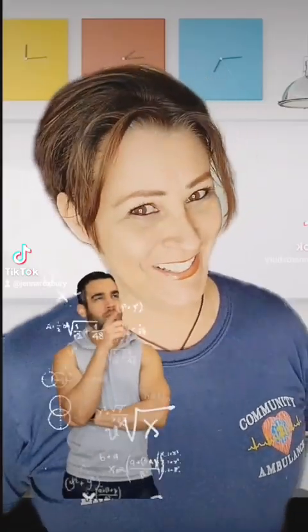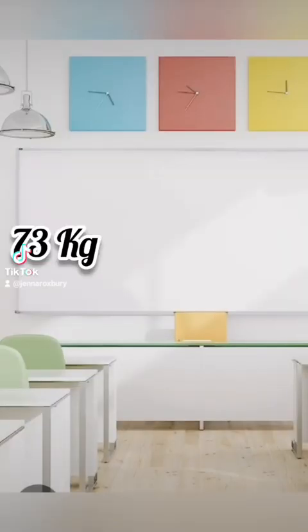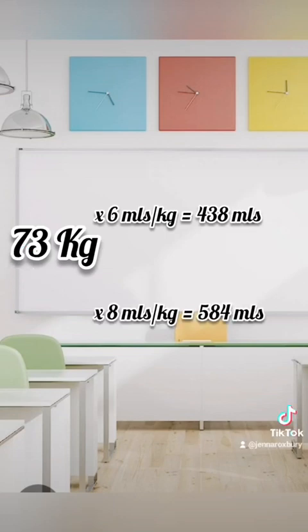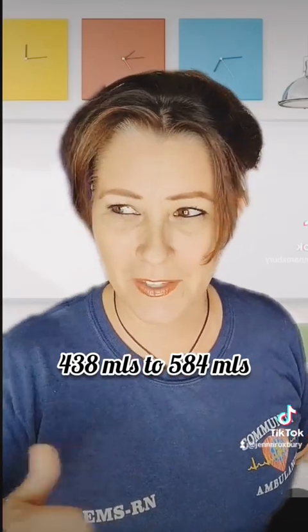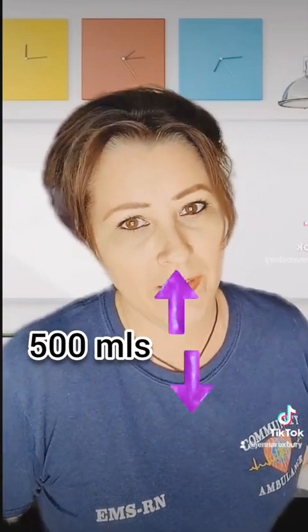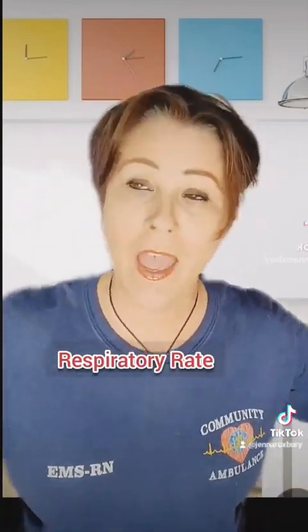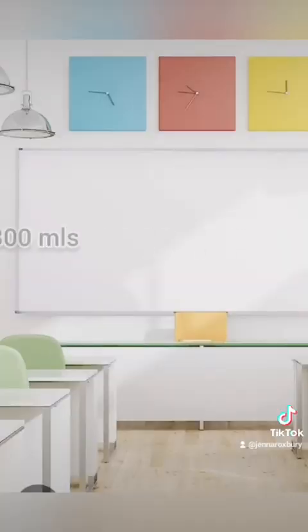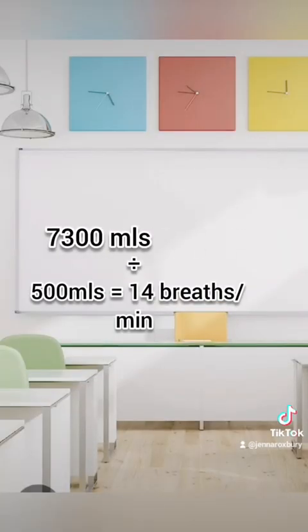Fun, another calculation. So you take your ideal body weight of 73 and multiply it by the low end of 6, and then by the high end of 8, and you get how many milliliters of air per breath. I usually pick something in the middle and then titrate up or down as needed depending on how the patient is tolerating those settings. Next up, respiratory rate. How many breaths per minute does my dude need? Take their ideal body weight, tack on 2 zeros, and then divide by their tidal volume, 14.